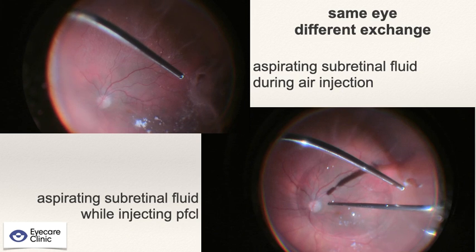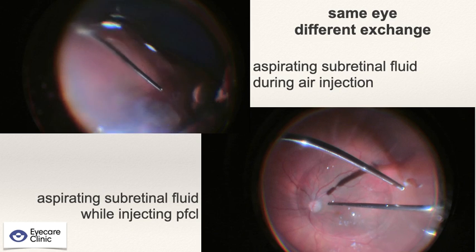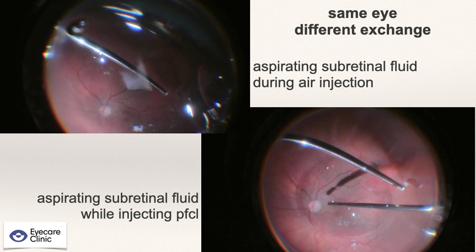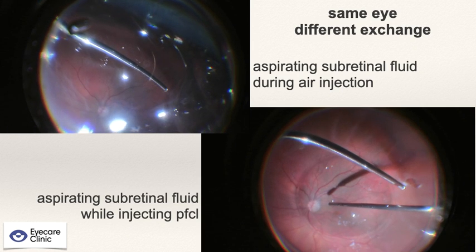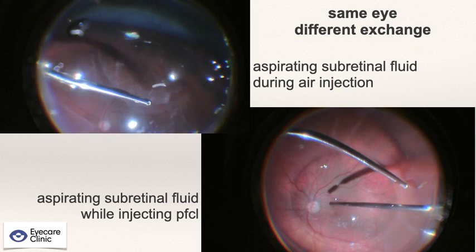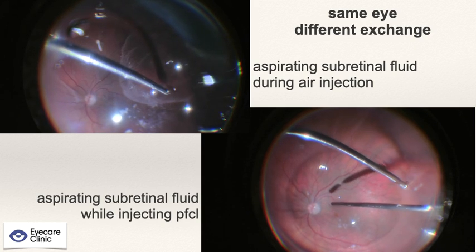This is a very common example. An eye with retinal detachment due to a supratemporal break. In the video on top, I am aspirating the fluid through the break with the vitrectomy probe during air injection. In the video on the bottom, I am aspirating the subretinal fluid through the break with the vitrectomy probe, while injecting first PFCL to flatten the retina.